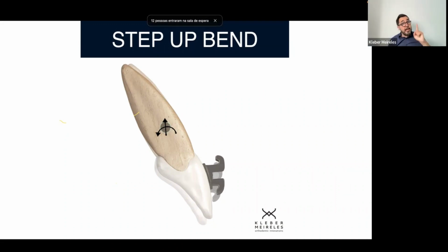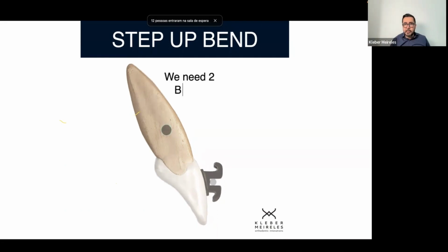What can I do if I'm applying just one line of action? Because I can do that by using rectangular arch wires and applying the torque. I'm jumping a little bit ahead here, but you know that. But if I'm using, for example, 018 round arch wire for that, what's going to happen? How can I manage to control this?